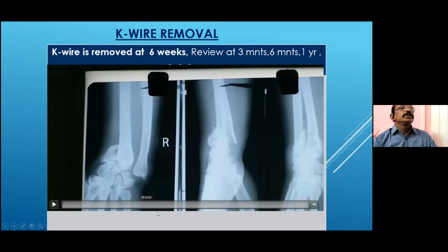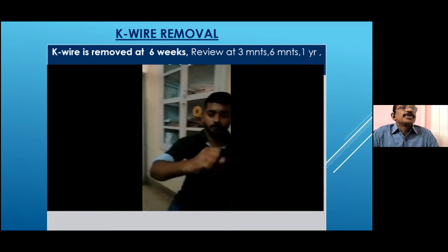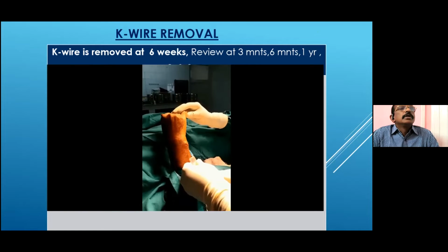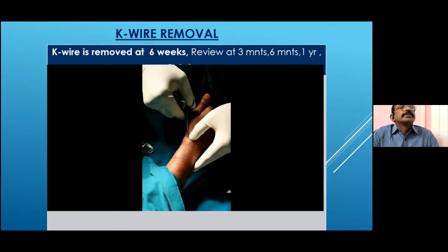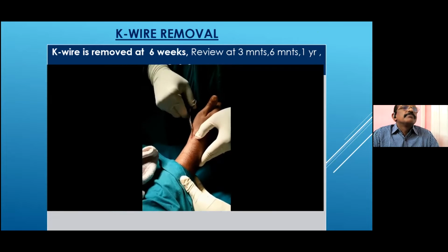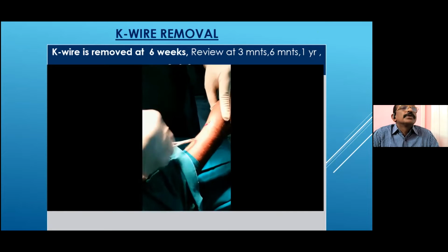The wire is removed at 6 weeks. That is, after 3 weeks or 4 weeks, the patient is permitted to move the wrist joint, the anteroposterior direction movement. No rotation is allowed during that period. The wire is removed with a stab incision so that no stitching is needed. A small wire extractor is there, through which we can pull out the wire from the subcutaneous plane. You can see.